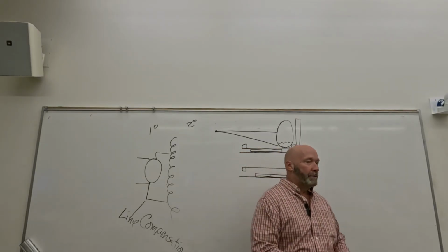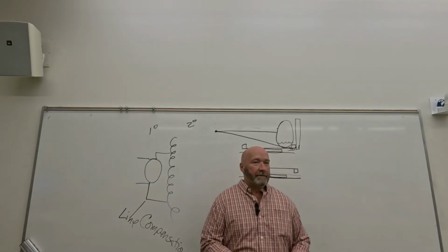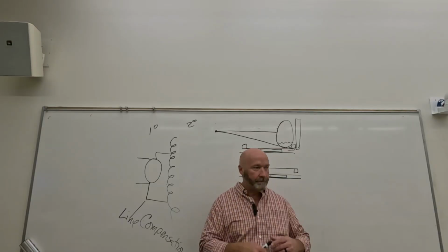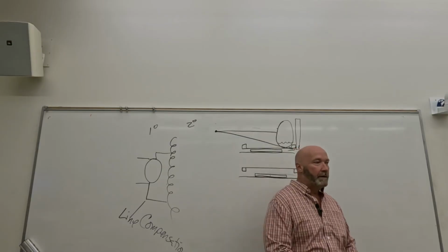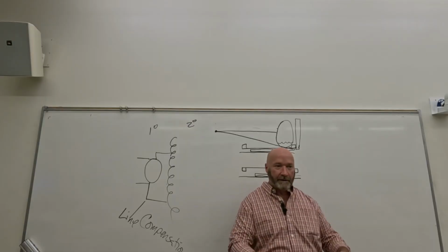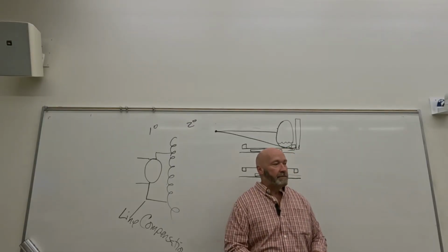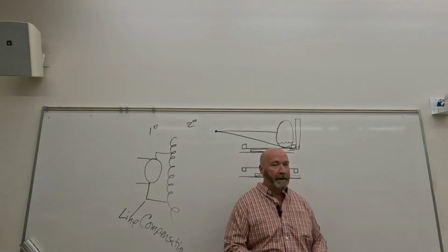But as far as the footboard goes, the footboard can come off, right? So that if you're doing a modified barium swallow for, say, post-stroke, to see if the patient's swallowing well, that footboard has to come off so they can put that special chair in there. So you scoot the chair in there, you take the footboard off. Then your next patient comes in, they're upper GI and they can walk, right? So you put the footboard back on.